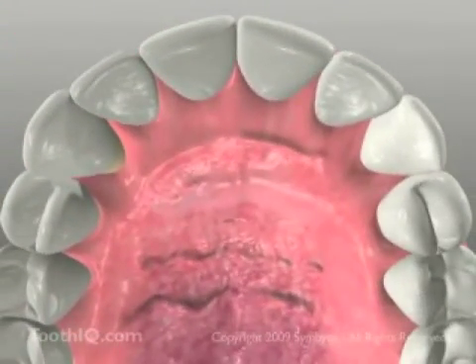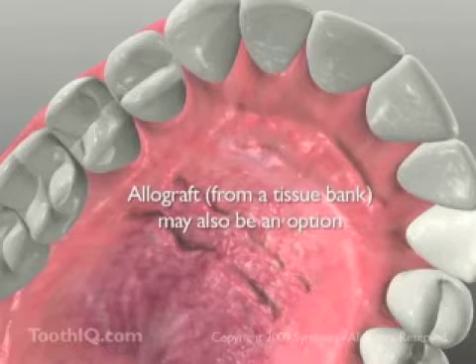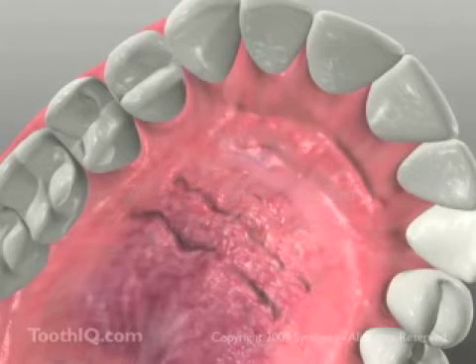The tough keratinized tissue of the patient's own palate is an excellent source for graft tissue because of its durability and the fact that it already contains the patient's own blood vessels and living cells.